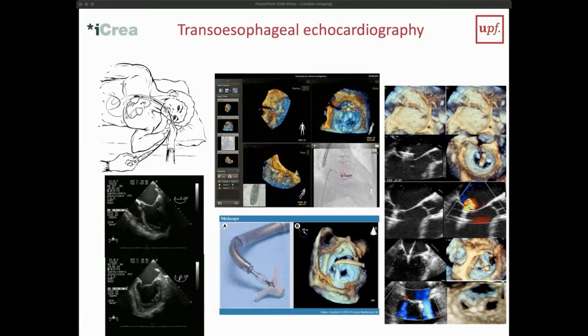Plus, the other thing that we said before is that if we go from one medium to the other, so if we go from solid to air to solid, we know that everything is reflected. Just like bones reflect everything, a small layer of air between the transducer and the skin would also not let ultrasound penetrate. So we need to use these ultrasound gels. So all of these are some disadvantages.